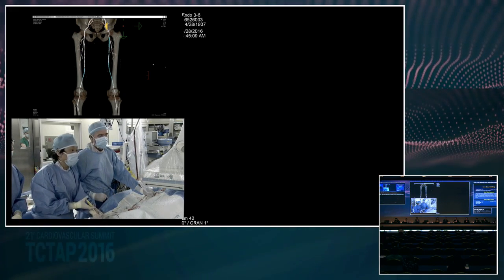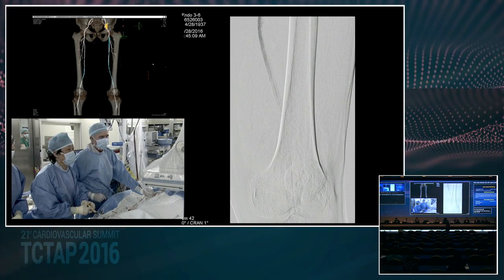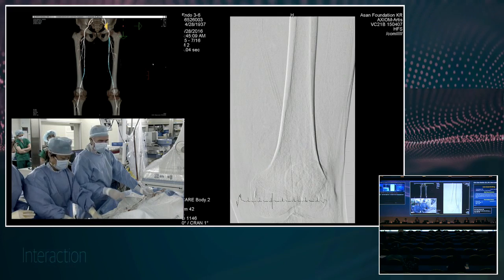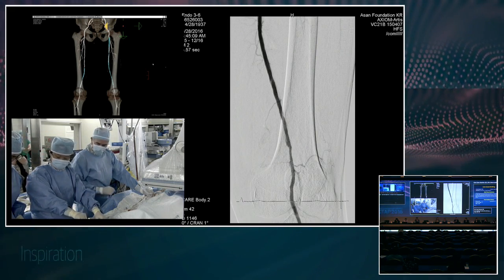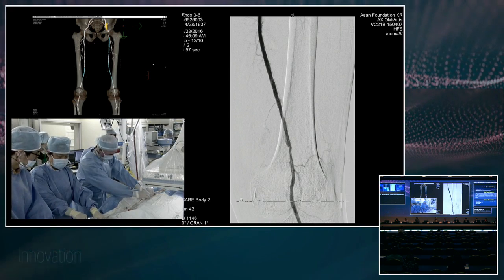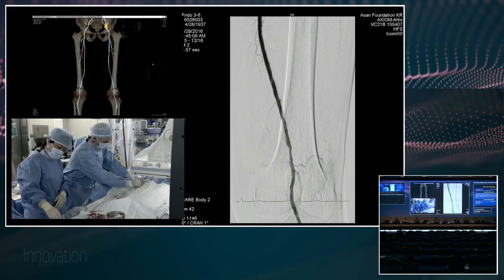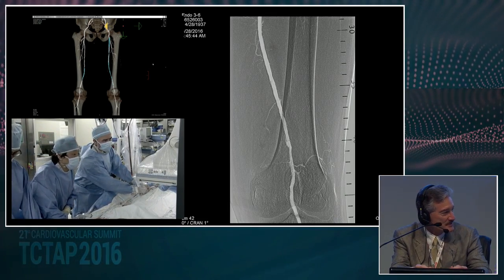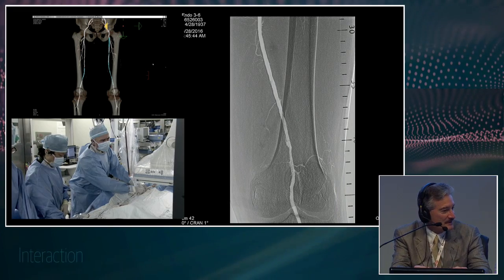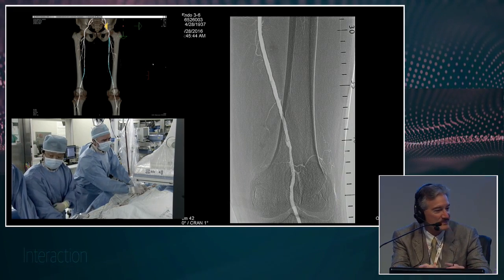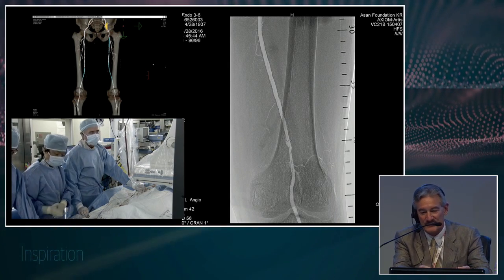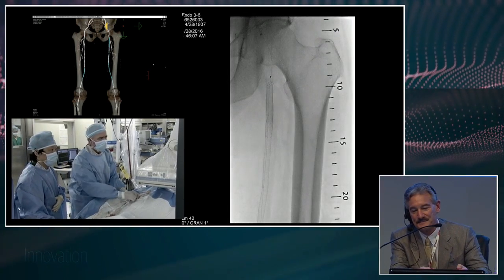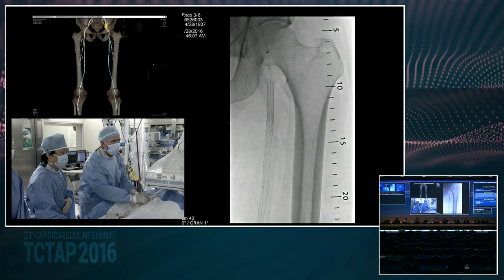We're going to do a DSA roadmap to help us line up our balloon with the inflation. We frequently observe progression of downstream disease after an intervention or surgery above. It's been recognized and published many times, and the mechanism is unclear. After revascularization you expect better flow to yield better patency, but you can see acceleration of downstream disease in the popliteal segment. It seems that when they originally stented this, that area of vessel probably wasn't significantly diseased at the time.